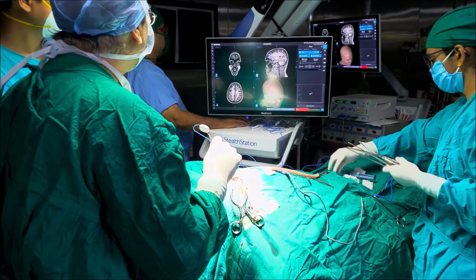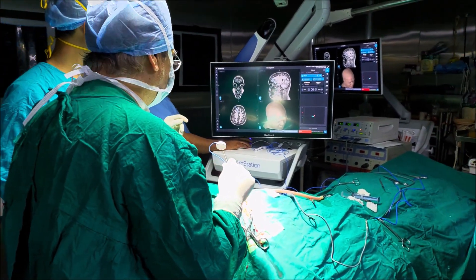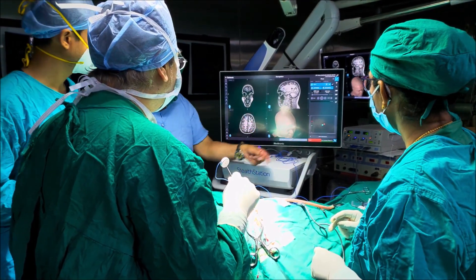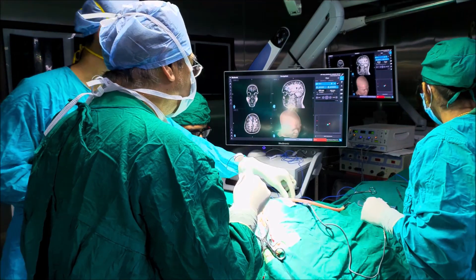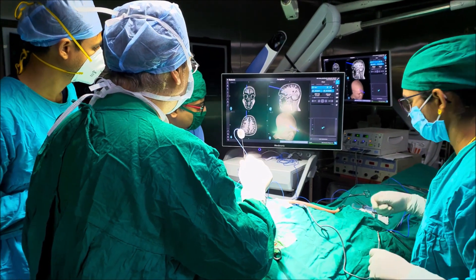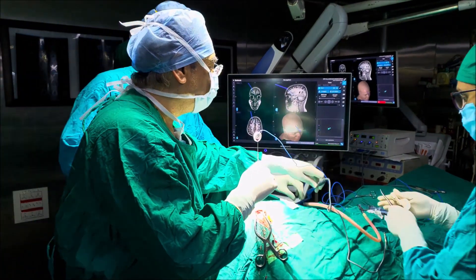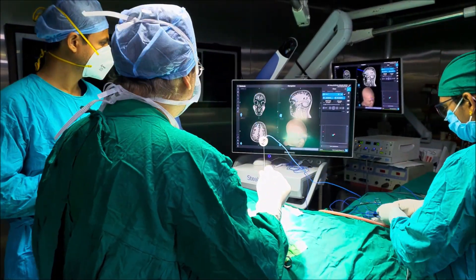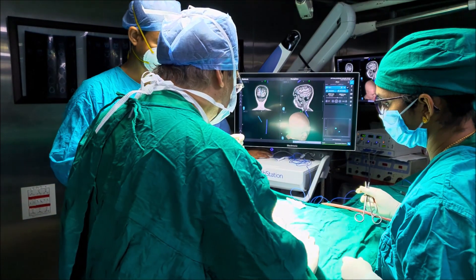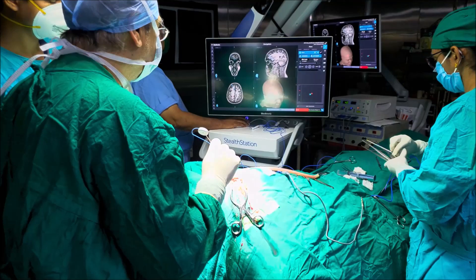This is the entry point on the right side of the midline. Once the part is painted and draped, we navigate and locate the point of entry into the cyst wall from the surface before placing the incision and planning the trajectory to the cyst. The burr hole is made, and extradurally we again plan the trajectory. The dura is then opened in a cruciate manner after placing the burr hole.